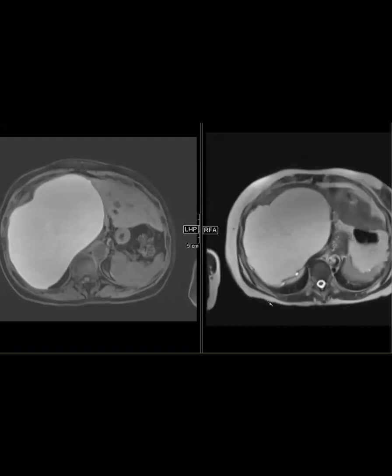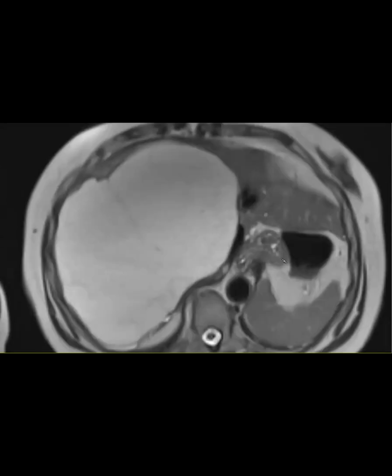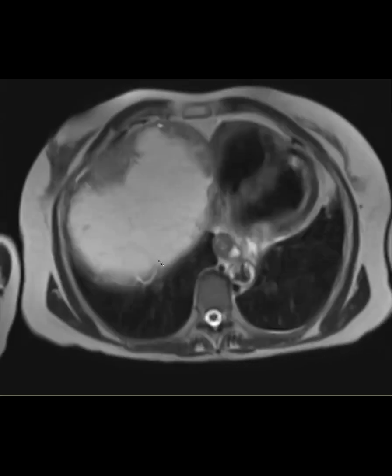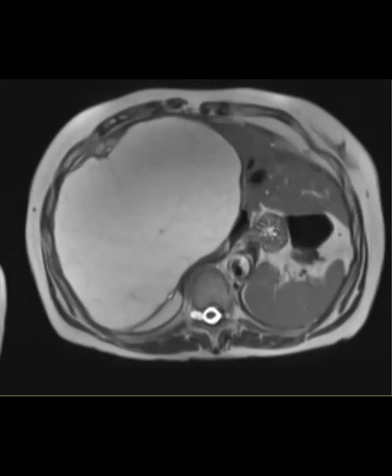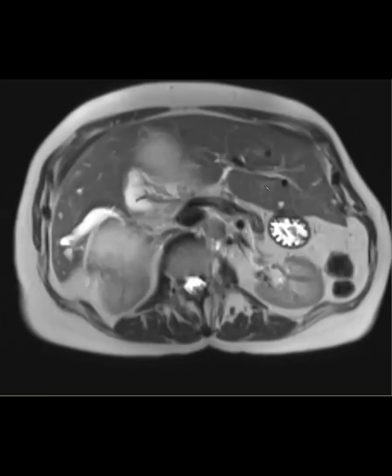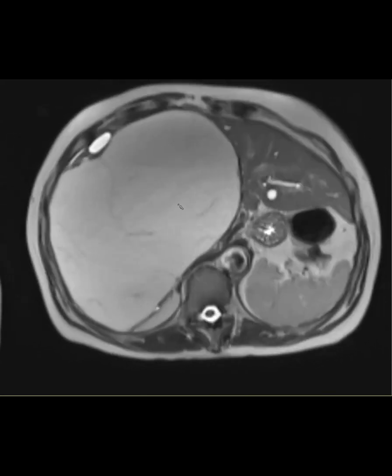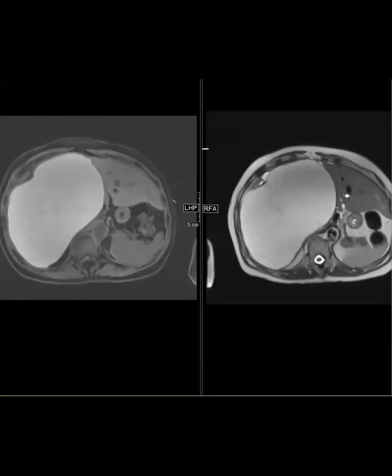Okay, good. So we did look at these septations. We were kind of hedging a little bit about it, but a couple of the clues that I was favoring that this was a cyst is that one, the patient has other cysts in the liver. Two, the MCNs tend to be in segment 4, the left lobe of the liver. This one looked kind of more like it was predominating in the right side, although you could say maybe it arose from segment 4 here. But it probably was coming from the right side. And then the T1 hyperintensity can really go both ways.